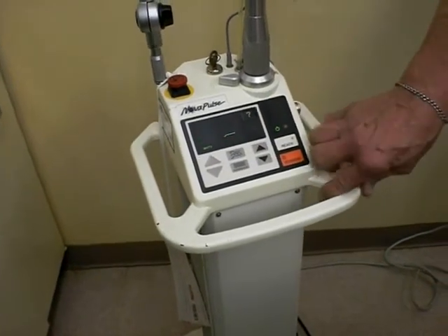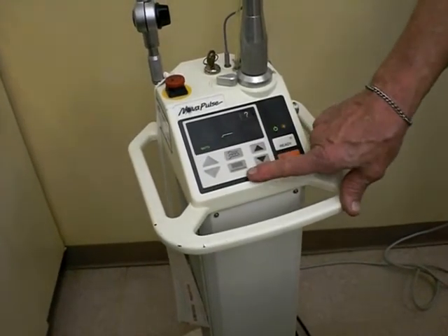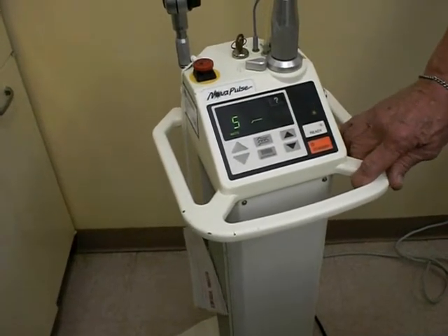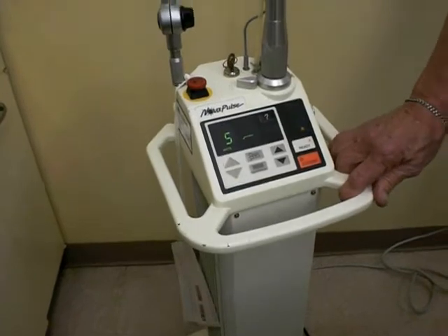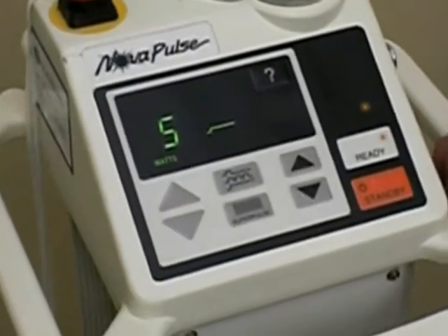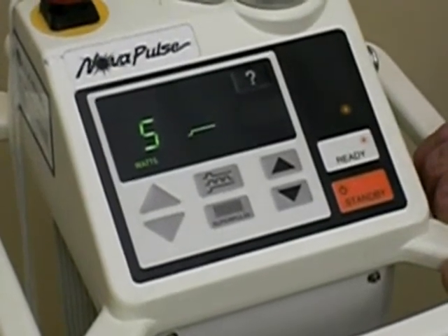The other thing that this machine does is it has a super pulse convenience setting. What that means is that the laser is turned on and turned off at very rapid intervals, and the purpose for this is to decrease any heat generation by the laser.